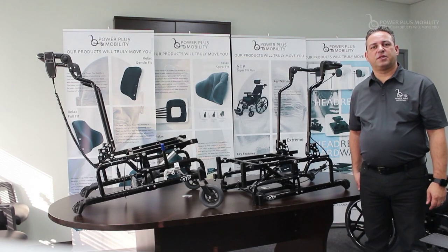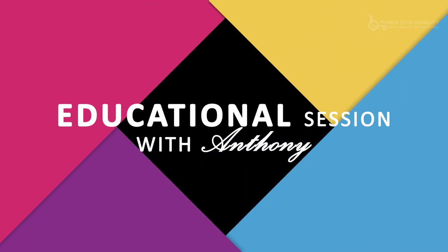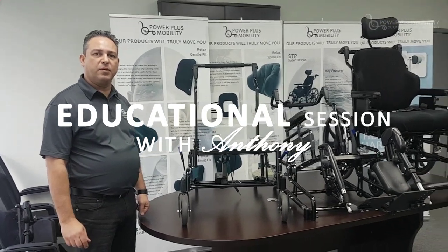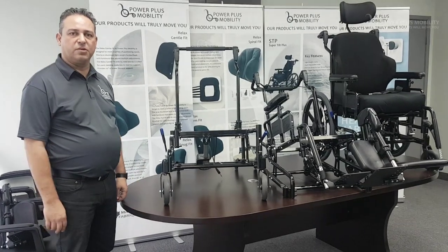Welcome to Power Plus Mobility's educational session. Today we're going to be talking about different types of front rigging on the chairs that we have in different types of styles and so forth.